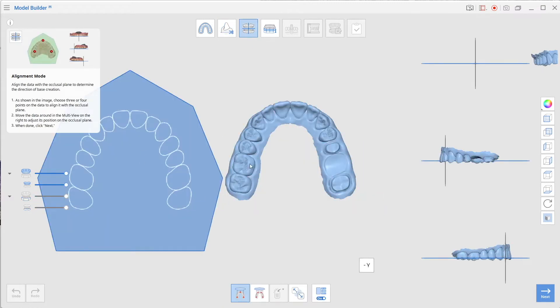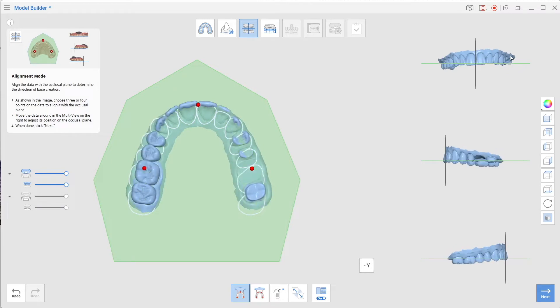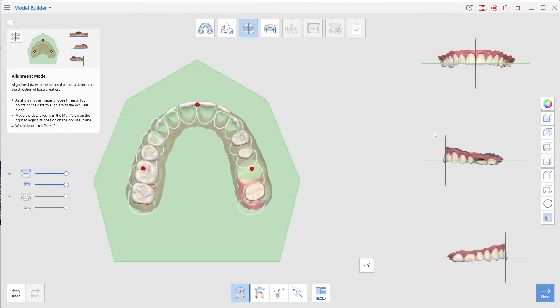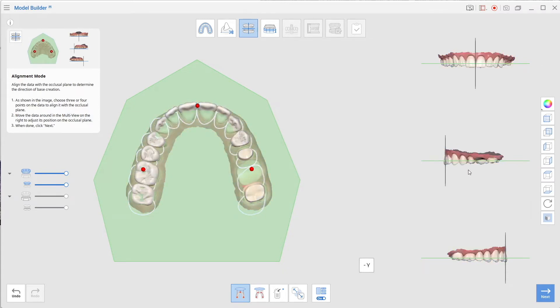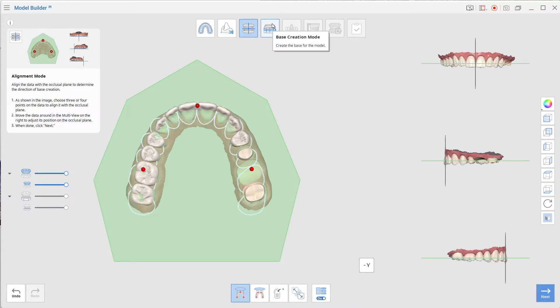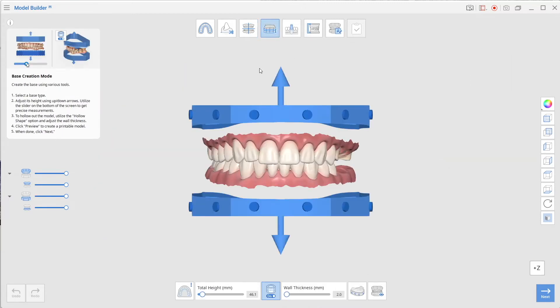I'm not going to bother with that because we've selected it pretty nicely, and we're going to the alignment stage. The alignment stage is easy as pie - you can see I'm just clicking three separate points and it'll automatically pretty much perfectly align. I'm going to hold down the right click to just align that arch into these little alignment positioning aids on the right hand side so that we get the arch in the correct occlusal plane and with the midline correct.